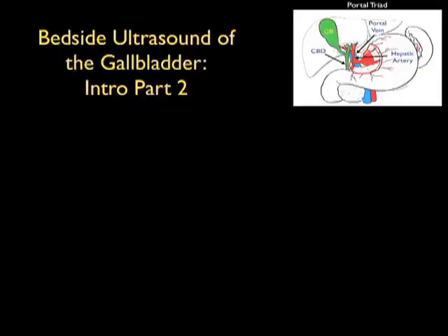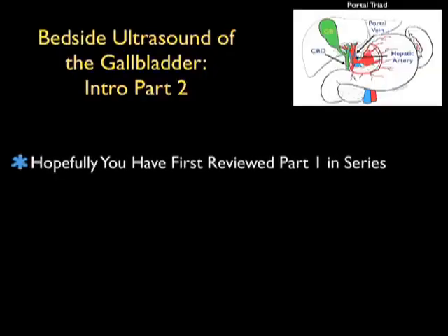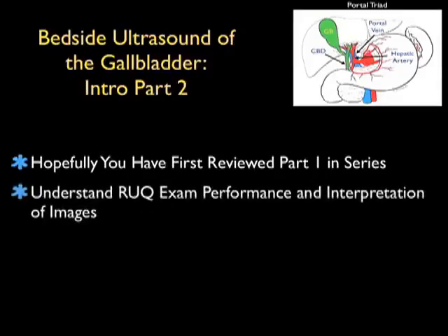In this SoundBites module entitled Part 2 of Bedside Ultrasound of the Gallbladder, we're going to go further on to our discussion of gallbladder sonography. Hopefully, first of all, you've reviewed Part 1 in the series and have a basic understanding of how to perform the right upper quadrant exam and also how to interpret the images that you will obtain.